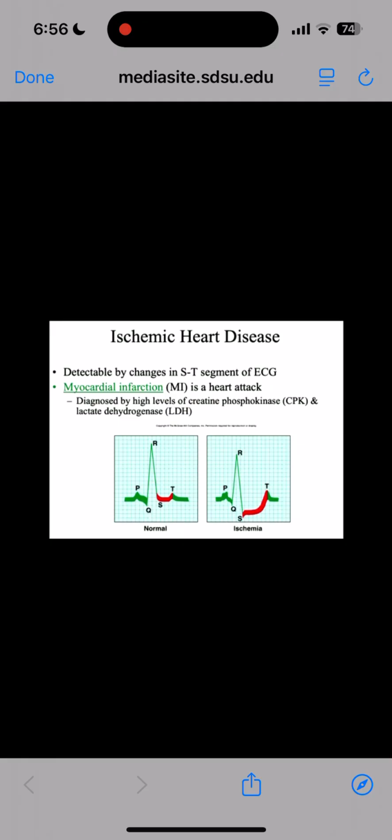And it shifts away from where the heart attack is. So now, if I'd had a heart attack up here, this dipole is now going to shift here. So my original dipole went in this direction, like this, and now with my heart attack, it's going like this. And if you look at the cross-section, these are going to look very different. This is why cardiologists can use ECGs to detect myocardial infarctions. They will be measuring every lead and seeing if the pattern makes sense. Okay? This is, again, what I was trying to say earlier.